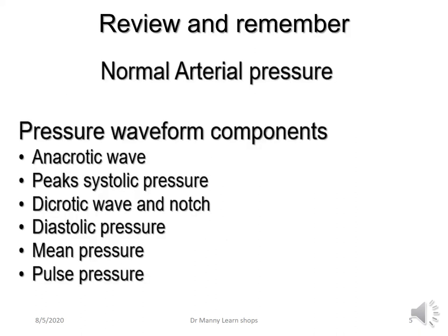Now, it's important to remember the normal arterial pressure waveform. And remember the normal components, which are the anacrotic wave, the peak systolic pressure, the dicrotic wave and notch, the diastolic pressure, mean pressure, and pulse pressure.